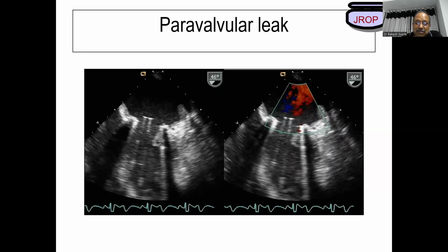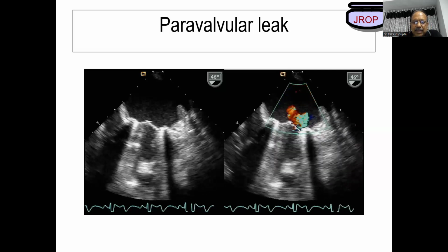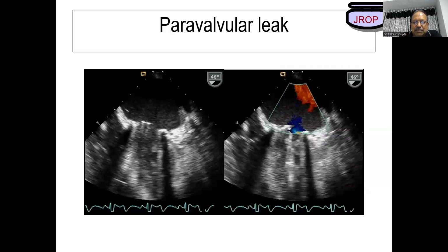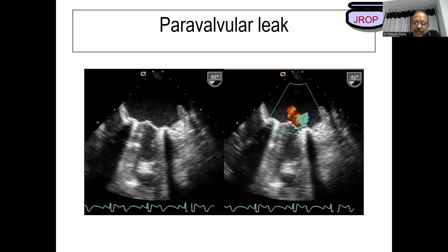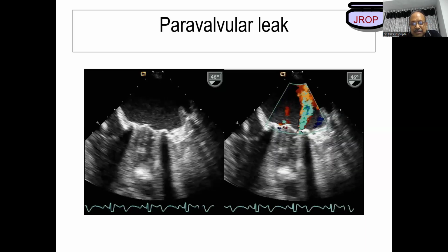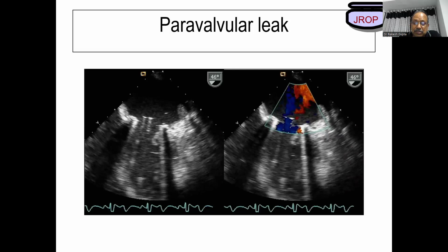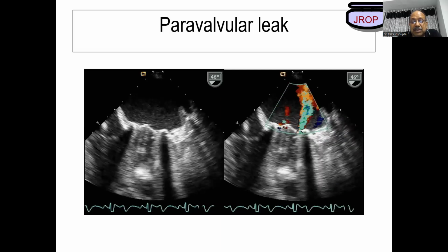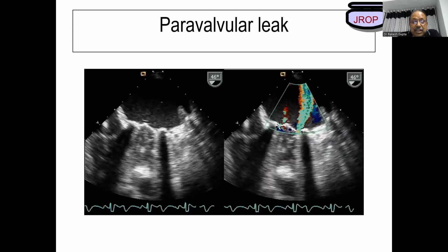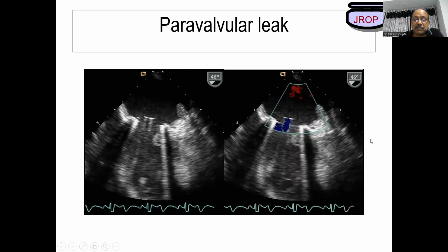Same thing, I'll quote an example. Patient had an acute anterior MI. I always tease this word. This is going to come in the next topics. Anterior MI, if you look, non-contracting basal anterior septum means it is a proximal LAD lesion. No thrombolysis will help. Only intervention. Same happens. One of the students called me up, boss, I've got an anterior MI, his BP is normal, his pulse is normal, but his basal anterior septum is not contracting. I said, move that patient immediately for intervention. He said, he'll take about an hour to reach. I said, forget about an hour. He'll die in the next hour.